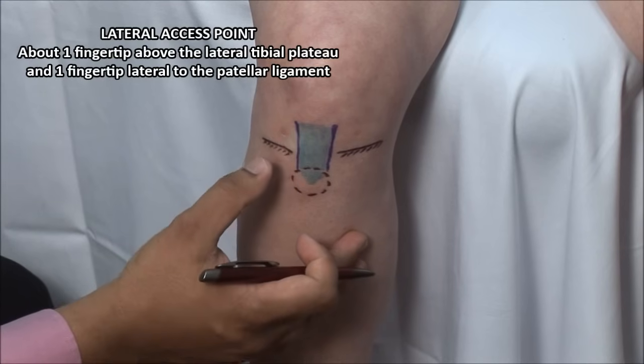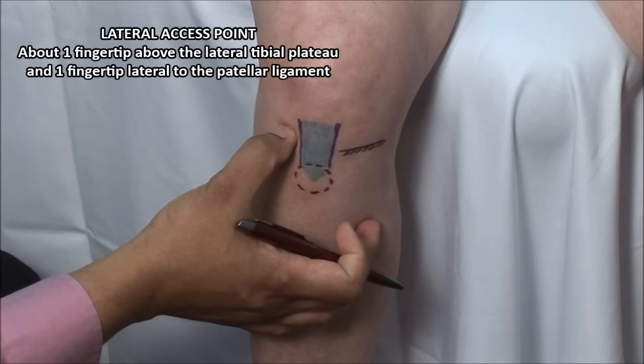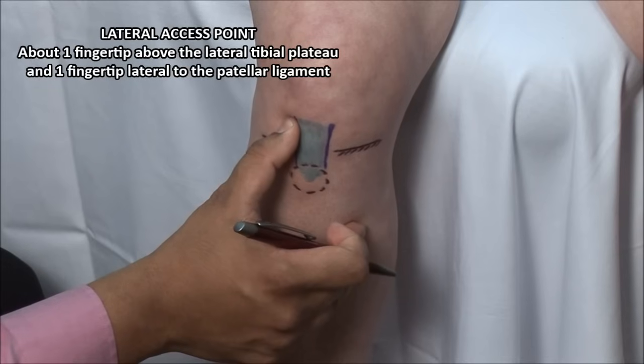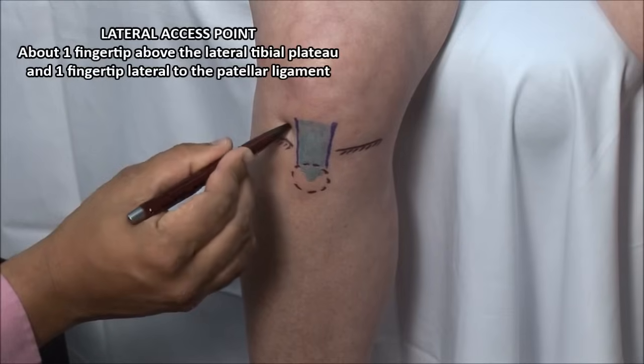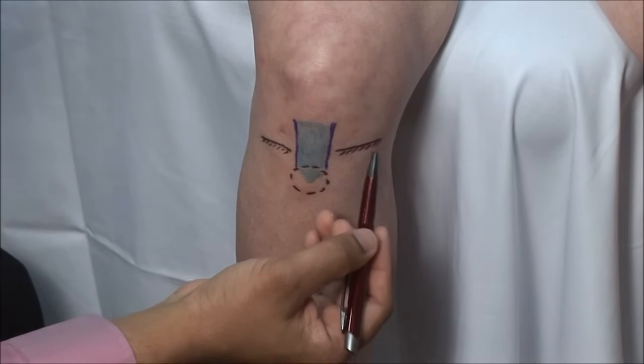Using a retractable pen, mark a point about one fingertip above the plateau to avoid the meniscus, and one fingertip lateral to the patellar ligament in the soft spot. The injection can also be done medial to the ligament.